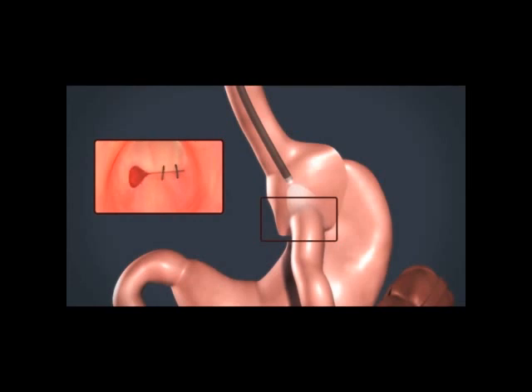By placing full-thickness permanent sutures, the stoma is first reduced back down to a size of 7 to 9 millimeters. Then the pouch is reduced.